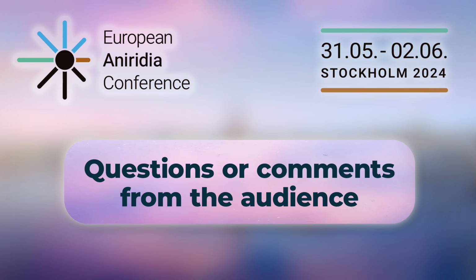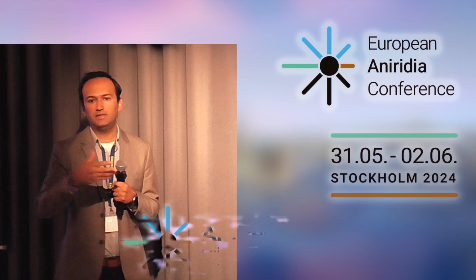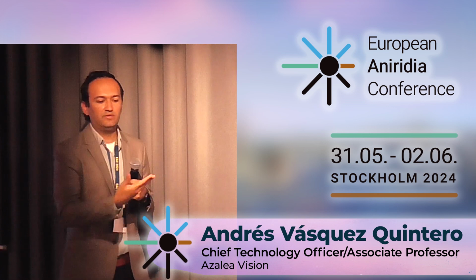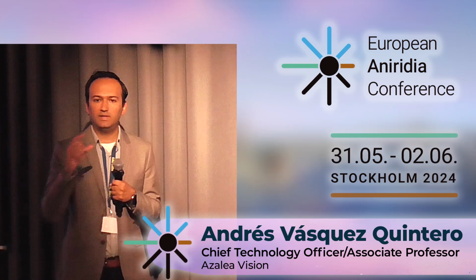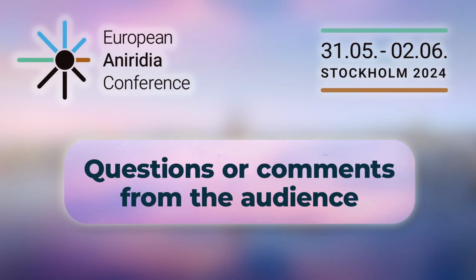So typically, is it compatible? There is always a flow of liquid from the outside to the inside. So it's not that the liquid stays there for the whole day. Underneath the lens, there are some pads for the liquid, the tear fluid, to flush, let's call it, the liquid that is inside. So the moment you put drops, they can also permeate and go underneath the lens and then into the cornea. So the patient doesn't need to take out the lens to give the drops, because not all the lenses are compatible with artificial tears. That's why I ask. Yes, correct. So this one can be used with artificial tears.